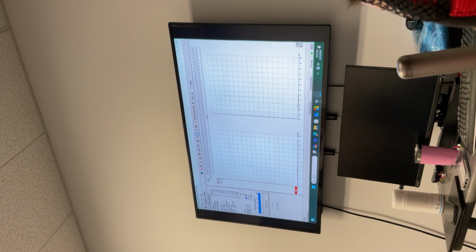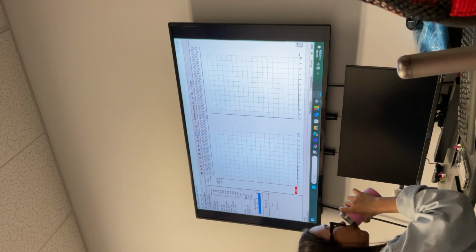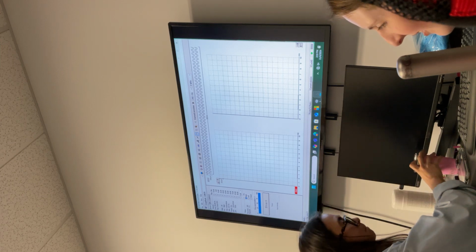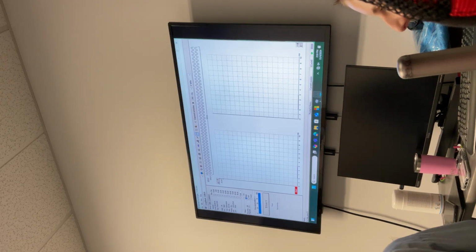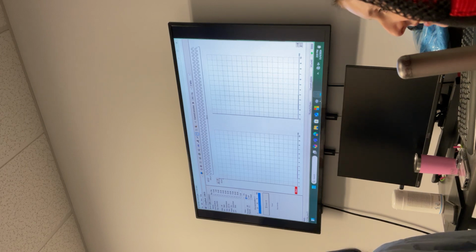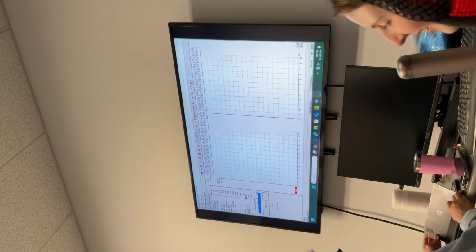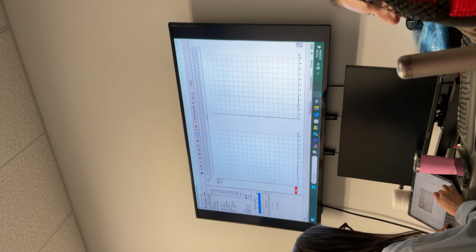I think you can go from 70 to 30. If the EEG is really quiet, you can go to 20. And the number of sweeps all depends on two things: the inherent response amplitude and the residual noise. On that particular patient, how is the amplitude and the noise, what intensity you're playing, you make the decision. It's all about you being confident that the response is present, and the end goal is to find the threshold. If everything goes good, you can finish the lab in like 30 minutes.